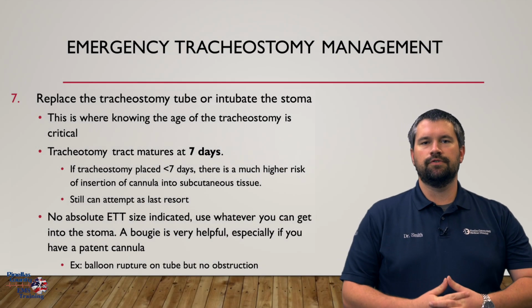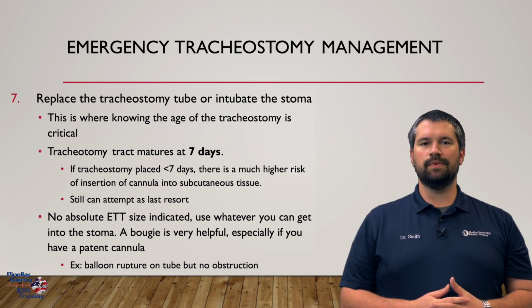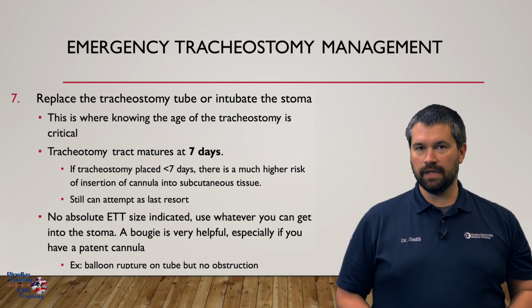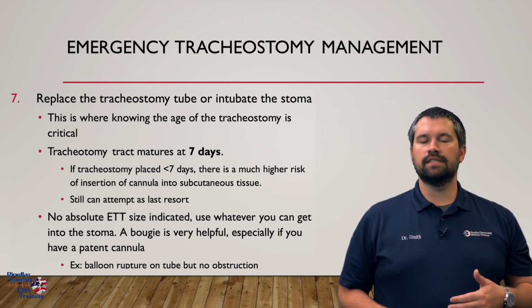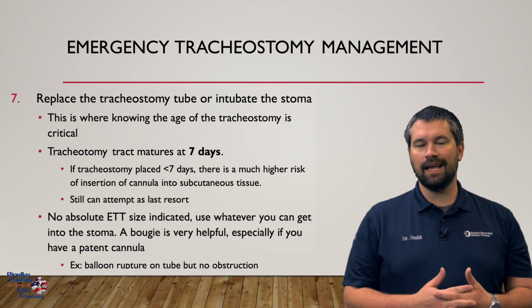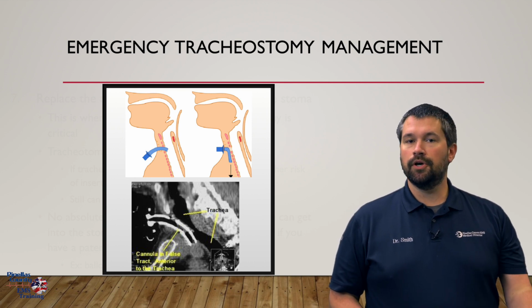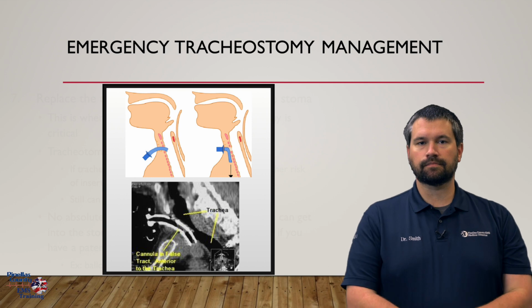Now it's time to replace the tracheostomy tube or intubate the stoma. This is where knowing the age of the tracheostomy is absolutely critical. The tract is not considered healed and matured until 7 days after it's been placed. So if the patient's only had it a few days, there is a very high risk that putting an endotracheal tube through the stoma could end up underneath the skin and the patient could suffocate very quickly. If the tract is at least 7 days or older, you are totally safe to go ahead and try to replace the endotracheal tube by hand.